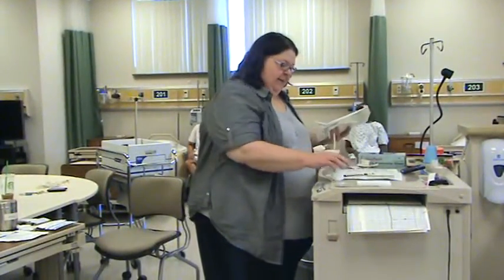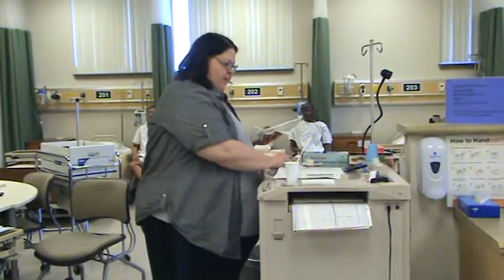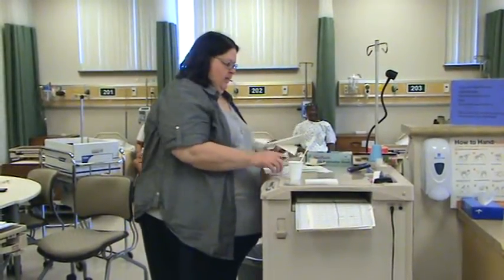This is one of the few things where I don't need alcohol wipes or two-by-twos. Let's go see Mr. Pooh and tell him what we're going to do.